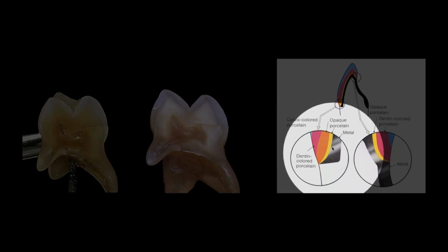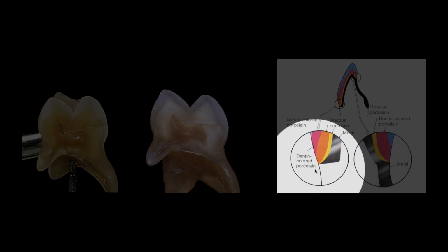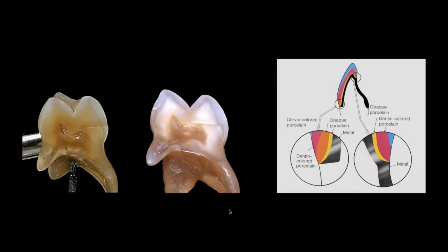What do I mean by that? Well, can you really put opacious dentin that thin and have it do something for you? And the answer I would give you is no, because the opacious dentin is only as opacified as the thickness that you're using it. The thinner and thinner I get with it, the less opacity I have with it. That's why when I made those 2 first cases where I had to use my opacious dentin to really extend, I used something with fluorescence in them to modify them a little bit and make them more opacified. And that was really the goal.